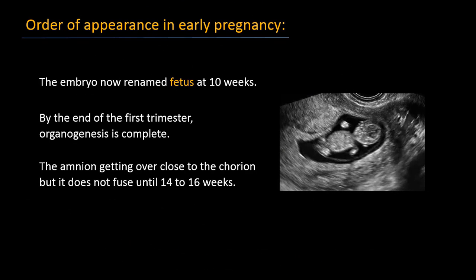The embryo is renamed fetus at 10 weeks. By the end of the first trimester, organogenesis is complete. The amnion is getting close to the chorion, but it does not fuse until 14 to 16 weeks.